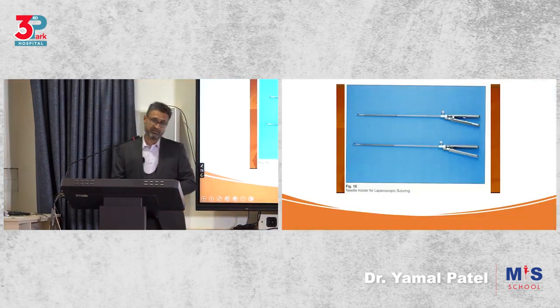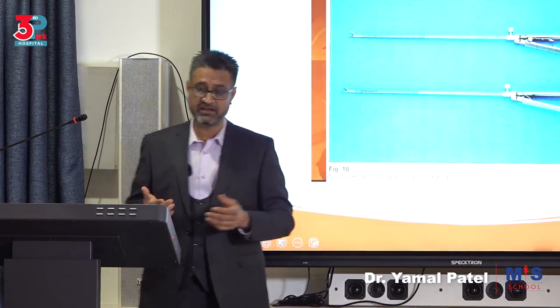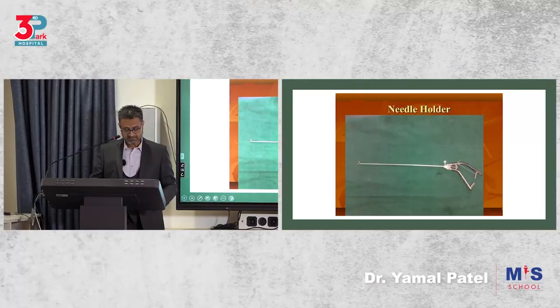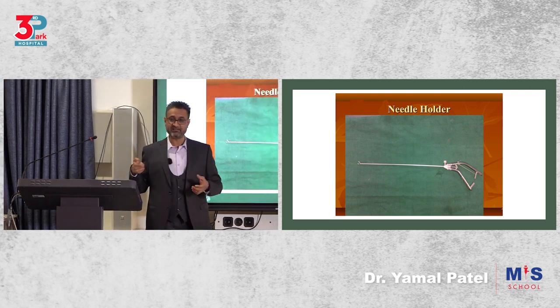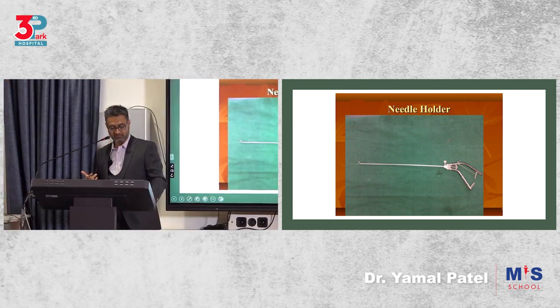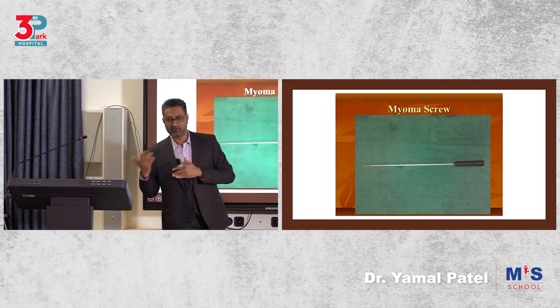Needle holders, obviously, one of the things that we are going to try and focus on in this training is the suturing, and we're going to have hands-on training on endotrainers about laparoscopic suturing. So for that, we need to know and work with the needle holders. There are different grips, pistol grip like this one, or a straight inline grip. So it depends on which type of positioning you have. Are you doing ipsilateral? Are you doing contralateral suturing?